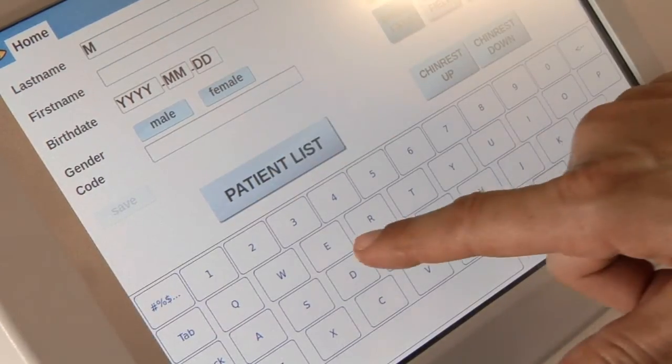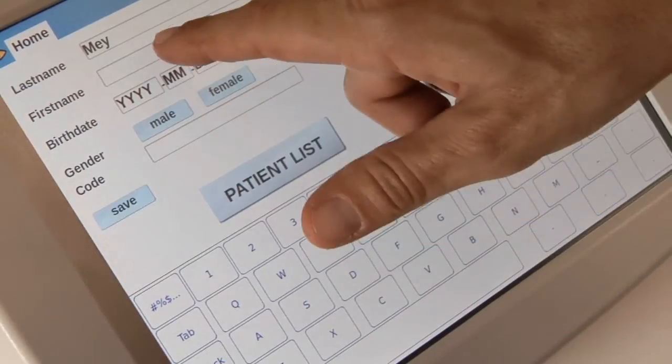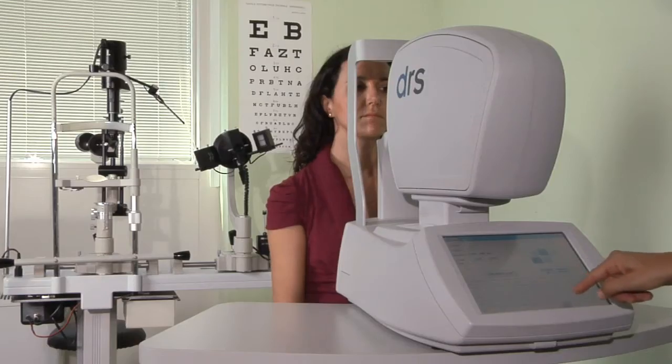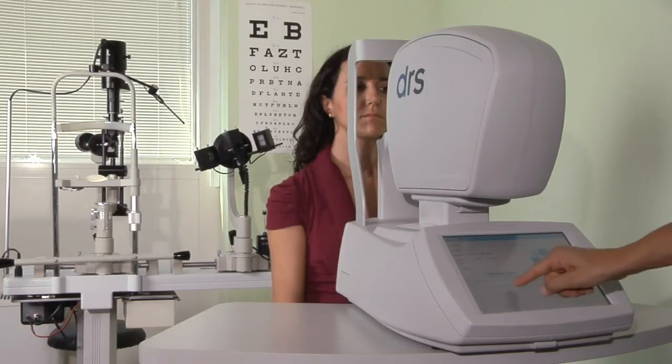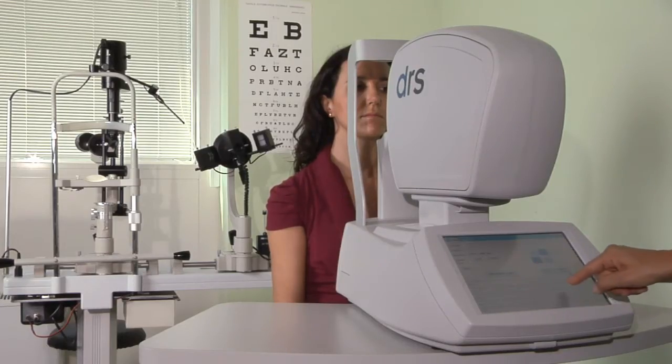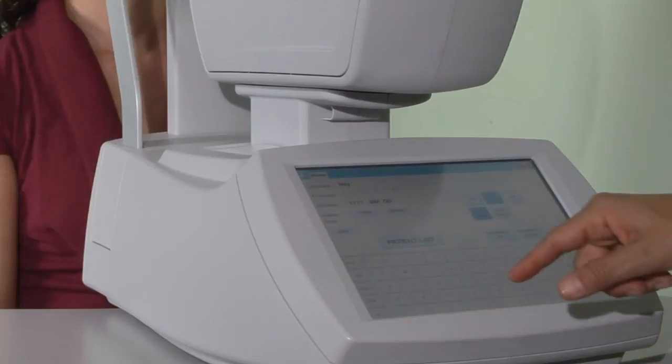Extremely easy to use and affordable, it features a touchscreen operation that requires minimal operator training.